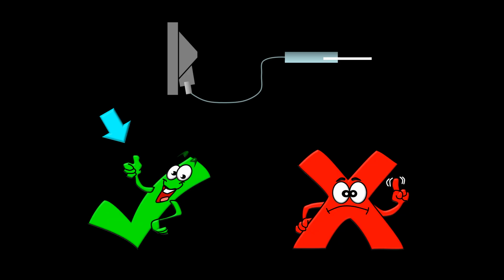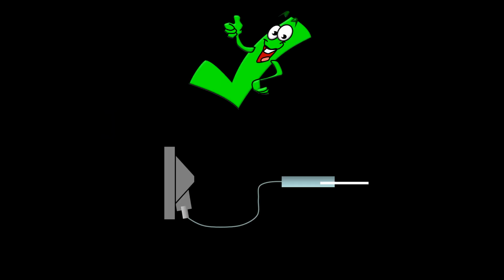Good surface EEG electrodes have a stable electrode potential and transmit information from the scalp to the EEG machine and from the EEG machine to the scalp with high fidelity. The good surface EEG electrode, if presented, let's for simplicity's sake say, with two negative charges in the form of ions at the disk, will interact with them and deliver an equal value of charges, let's say 2 electrons, at the other end. Good electrodes also conduct charges in the other direction. So if presented with 2 electrons at the pin, 2 negative ions will be discharged at the disk. We call this quality, that is the ability to carry charges in both directions, reversibility. So good electrodes are said to be reversible.